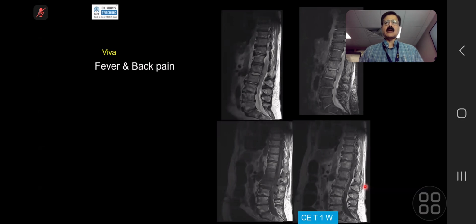So you should have a clear-cut concept, just remember it like that: infective inflammation which is enhancing is phlegmon. When there is a liquid component, which is the abscess, then there will be ring enhancement and the necrosed part will not enhance. Because they will ask you, what should we do? Should we go in? Should we drain it? So you will tell them, no, it is not drainable.